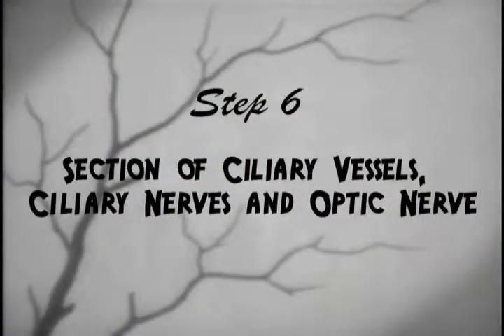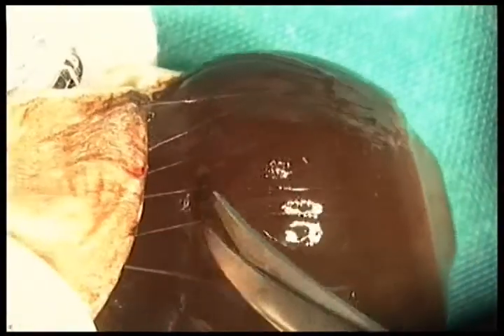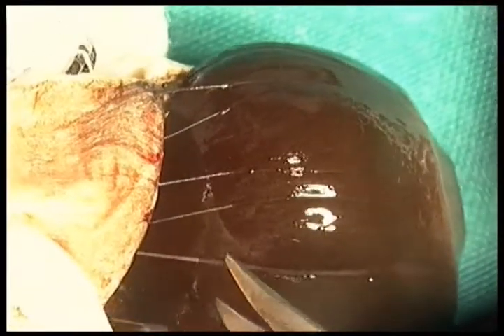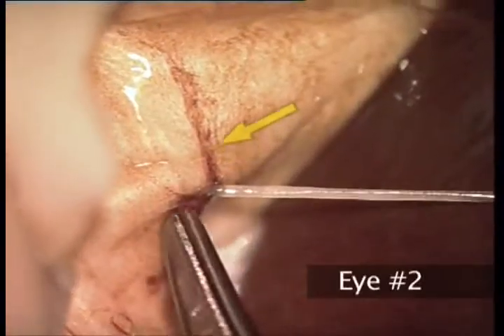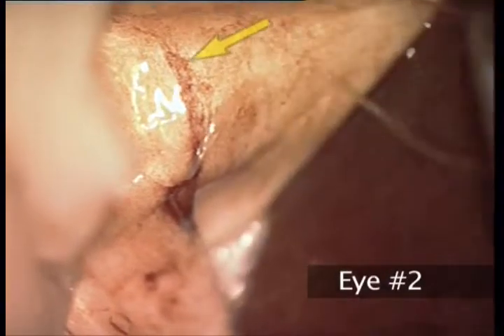Step 6. Once the extraction by extrusion is performed, it can be seen how the sclera is attached to the choroid by its posterior zone. The sclera is passed through by channels for nerves and vessels, as can be seen in this image.